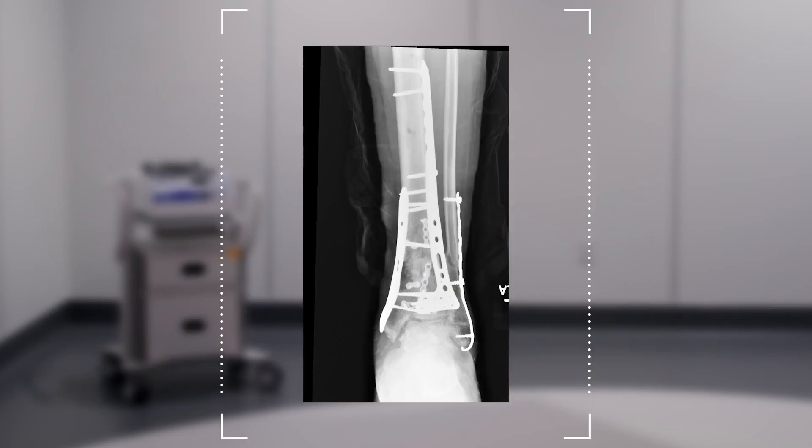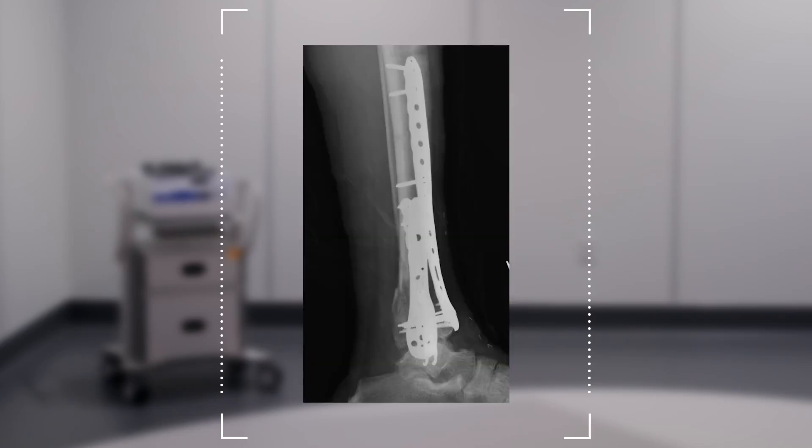At two-year follow-up, you can see maintenance of the talus centered in the distal tibia, maintenance of the articular reduction, and maintenance of that compressed distal articular surface so critical to support the talus for the best potential long-term outcome for this patient.